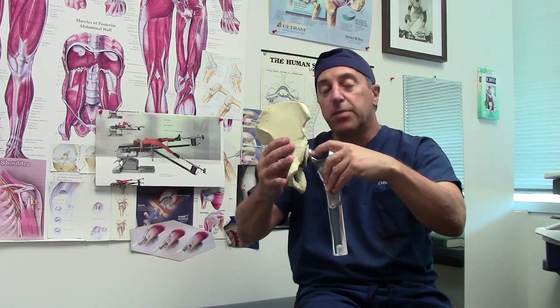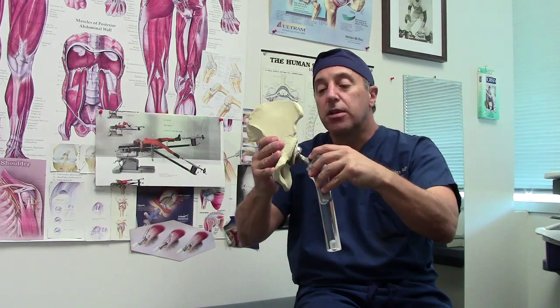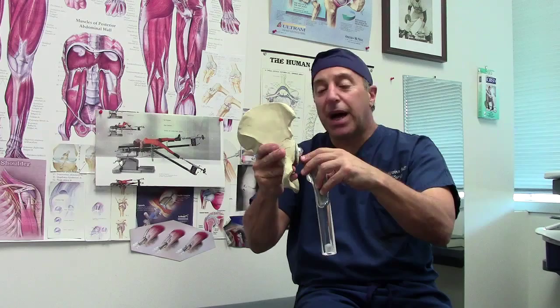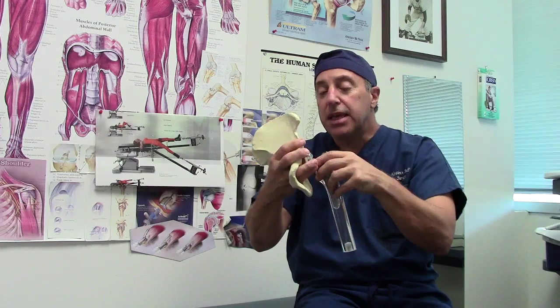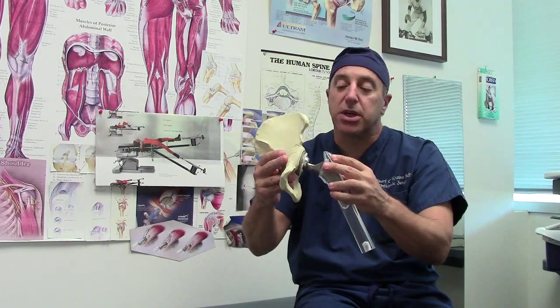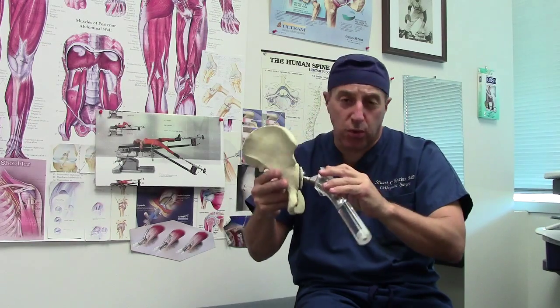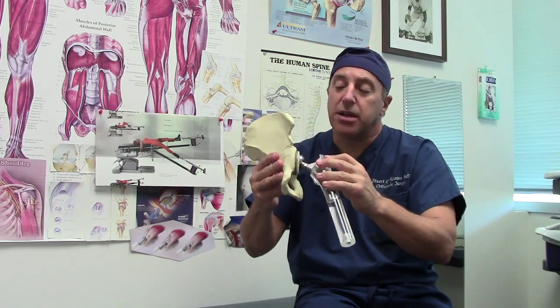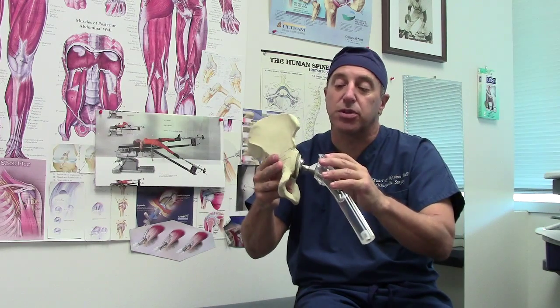We do cut some of the ligaments in the front in order to get the hip in, and that's why with any hip replacement there are precautions for about three months until the ligaments reform, because it is possible if you get into a funny position to lever the hip out of the socket. It's much less likely to happen with the anterior hip because the tension in the muscles holds the hip tightly in place. So patients with an anterior hip are allowed to do more things — they're allowed to tie their own shoes, sleep on their side, drive their cars, and get rid of their canes and crutches much faster.